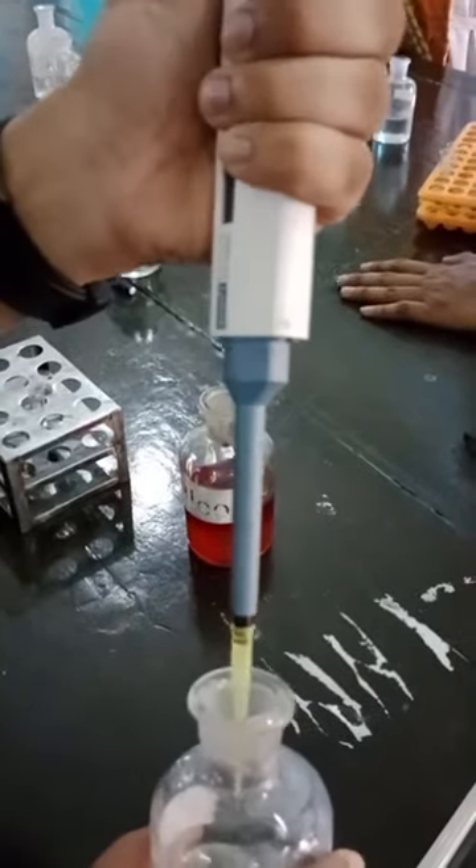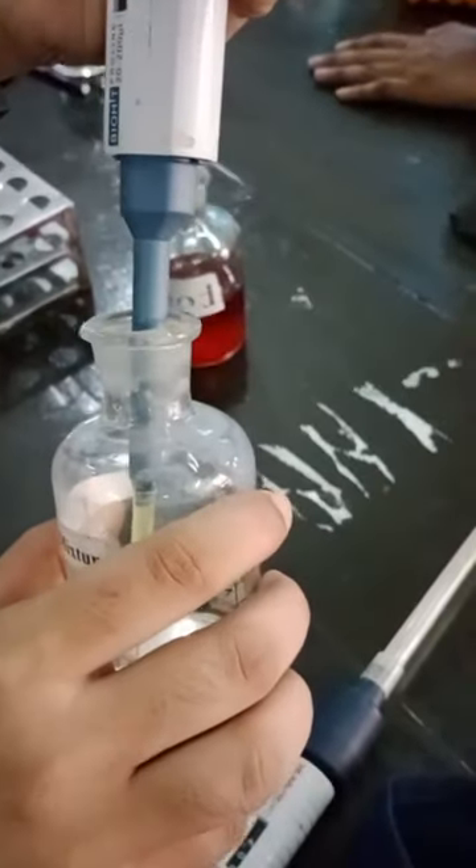First of all, don't press it hard. Press it slowly, then take it inside and release slowly.